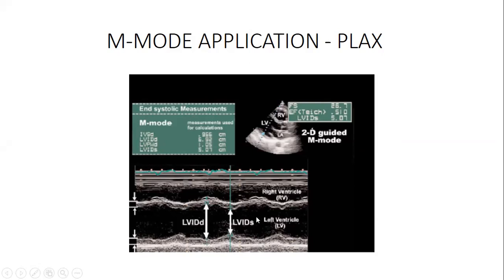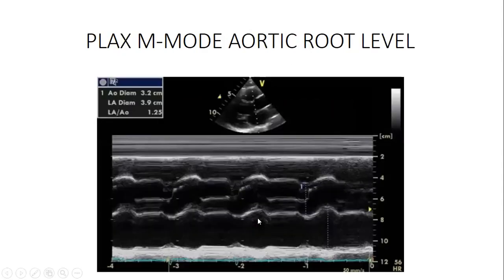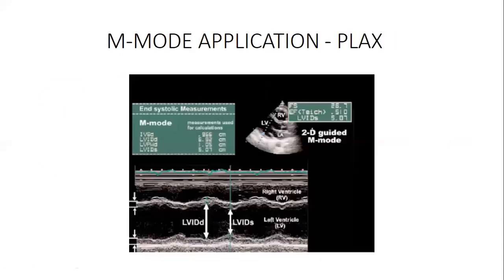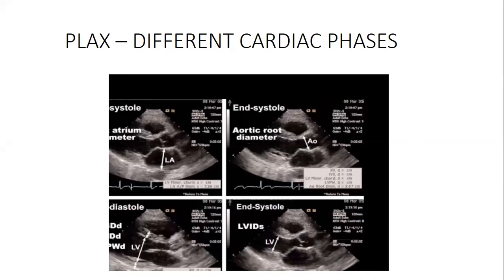Yes, it will reduce. So are we going to say the left ventricle has dilated? The answer is no. It has not dilated. In fact, I have something here.